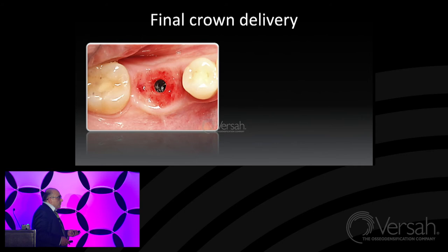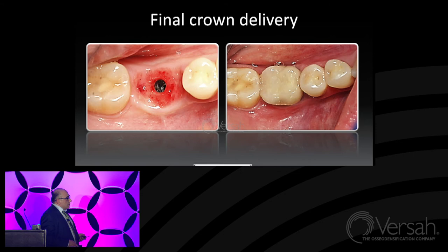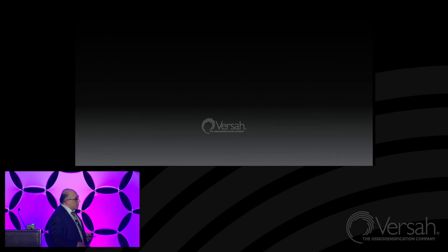So we just transfer the situation from the oral cavity to the laboratory and got our final restoration. And here is the final restoration attached to the implant. And control X-ray. That's the way we try to mimic nature every time we work with our soft tissue.